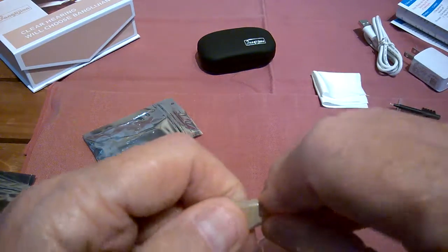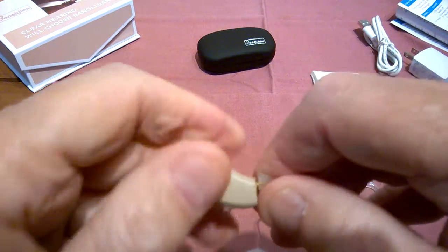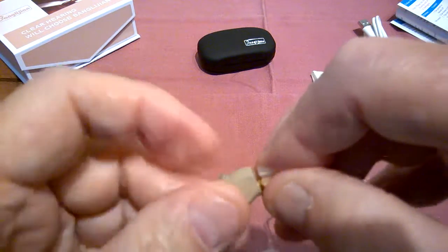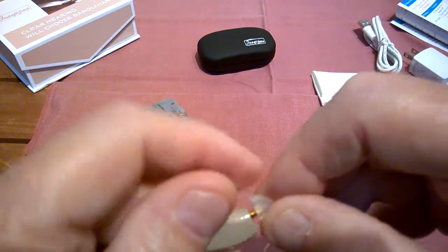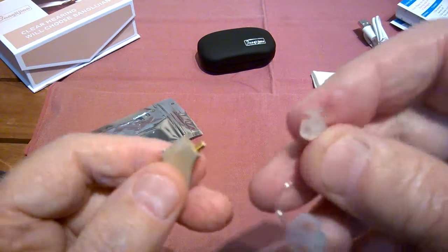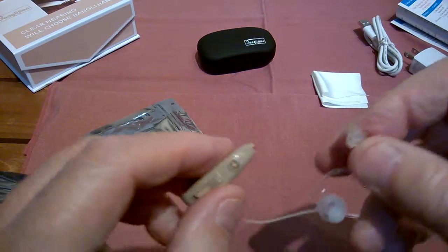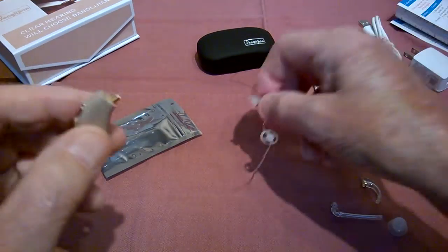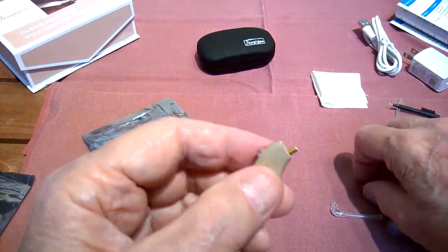Now these come with the left and the right tube, each one with its own little ear tips that you can try different ones to see what you like. Now there's 2 connections. So it'll work on your left ear or your right, but there's only 1 unit. So when I say left or right, don't become confused. There's only 1 actual unit.